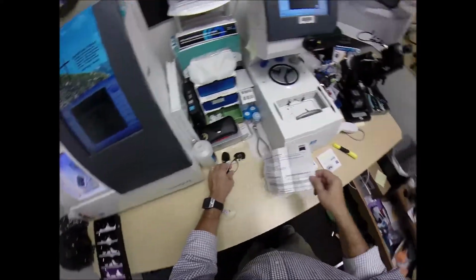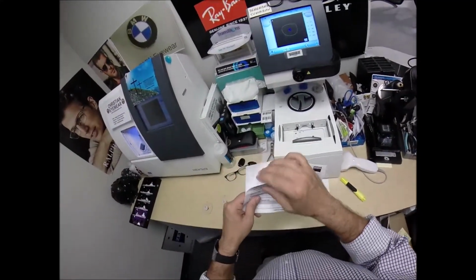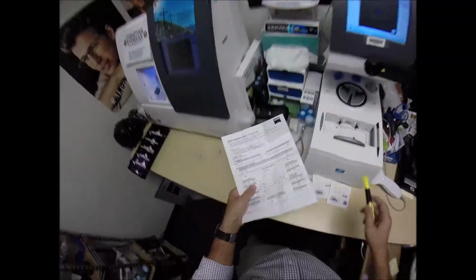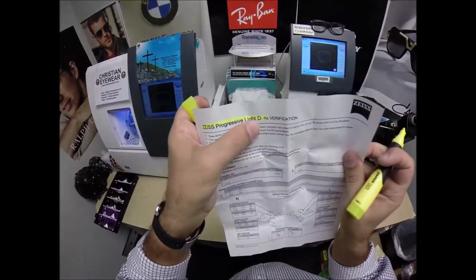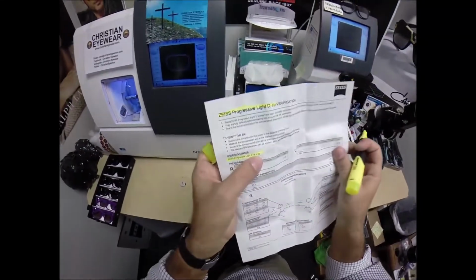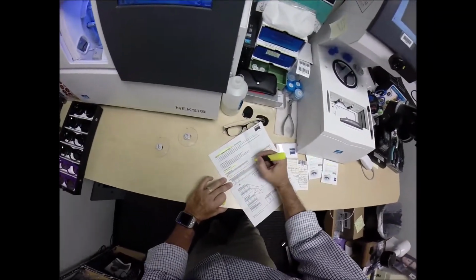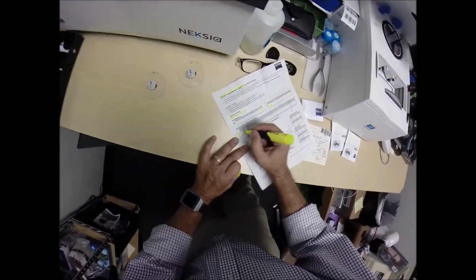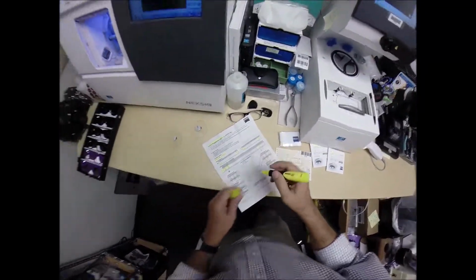Now, the other nice thing, so these are for your personal inspection. This is what you can take back to your doctors. The next time you go to the doctors and they just casually ask, what are you wearing? Tell them, Doc, I am wearing the Zeiss Progressive Light D, which stands for digital, freeform progressive lenses. Again, says the same thing right there with the refractive index, the corridor height, the prescription for the right eye, the prescription for the left, progressive strength for both eyes, your pupillary distance, the optical center height, and even the base curve of the lens.